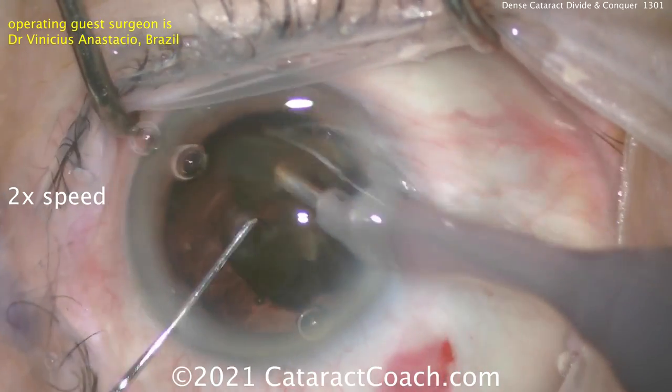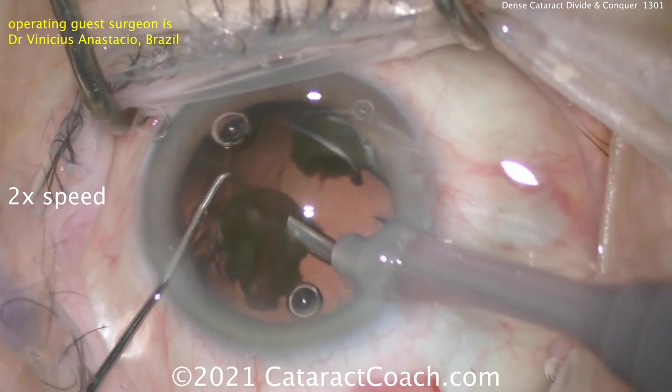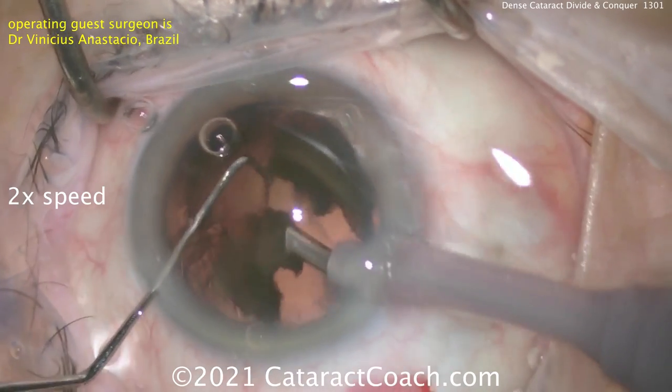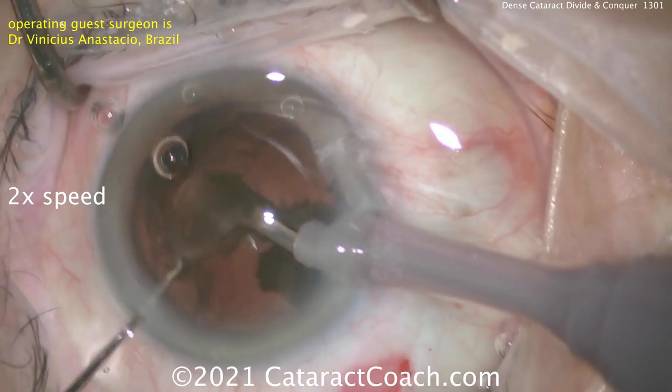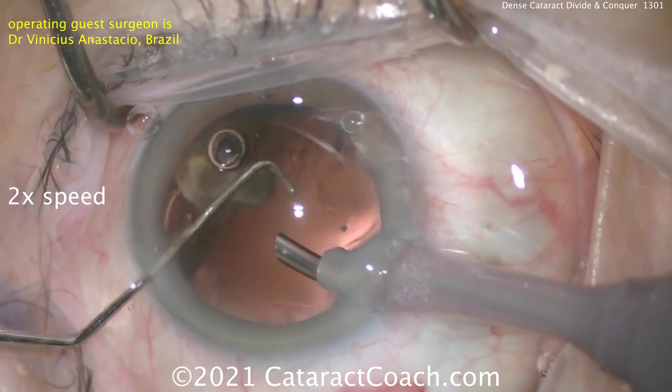Here come the last few pieces. Remember, there's not going to be much cortex. Now protecting that posterior capsule, getting the last couple of pieces up. Looks fantastic — very nicely done.